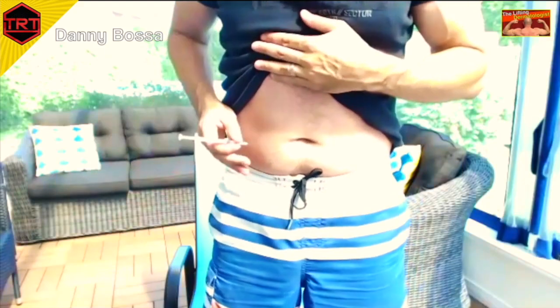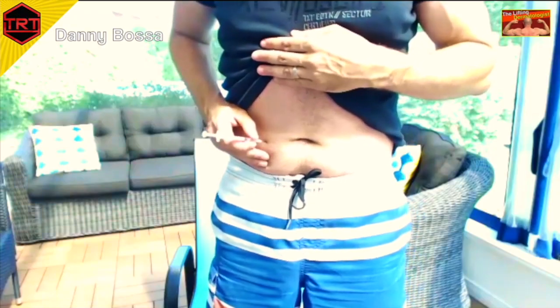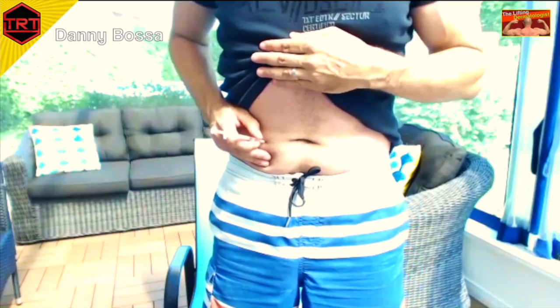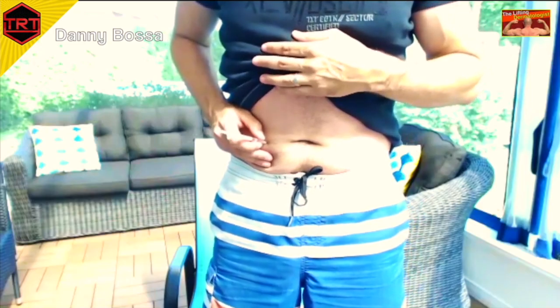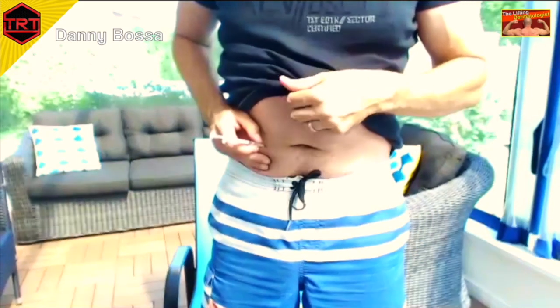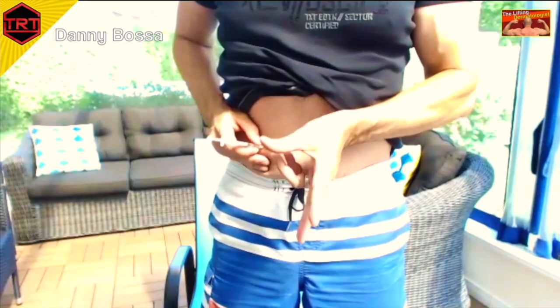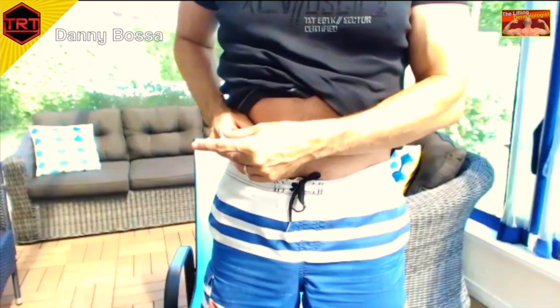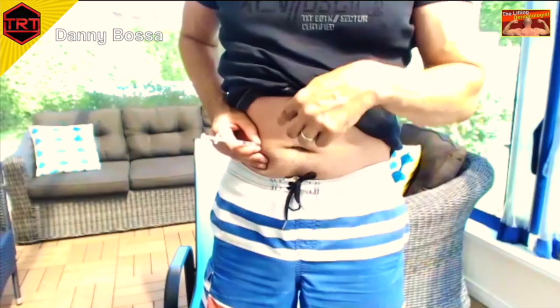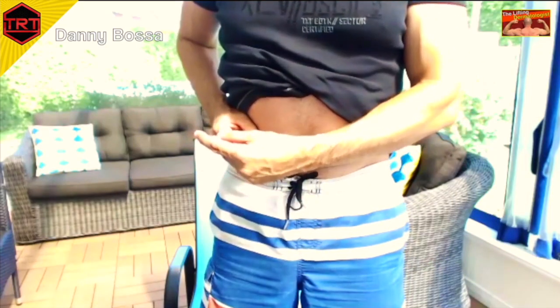Well, all I do is I just put the needle up against my skin, okay, and just push it through. Now, that time there, I literally felt nothing. There was no discomfort whatsoever of any kind. So I'm going to keep this guy stabilized with one hand, and then using my other hand, I will push on the plunger, okay? So I'm going to hold the base so my needle isn't moving around too much, and use my other hand to inject.